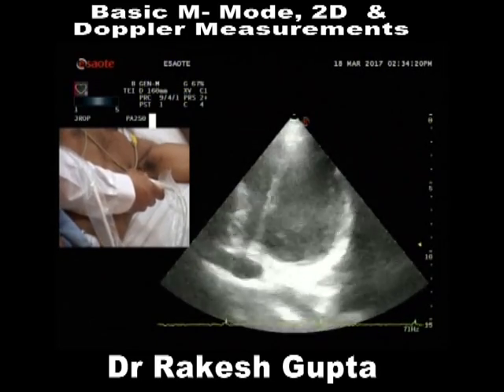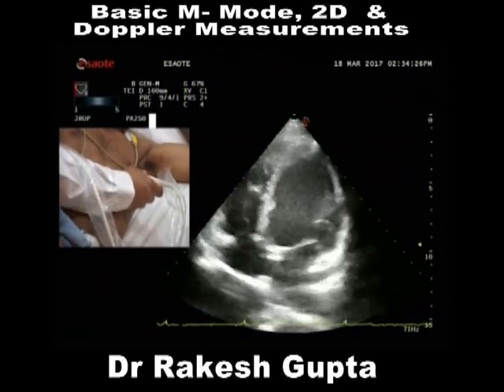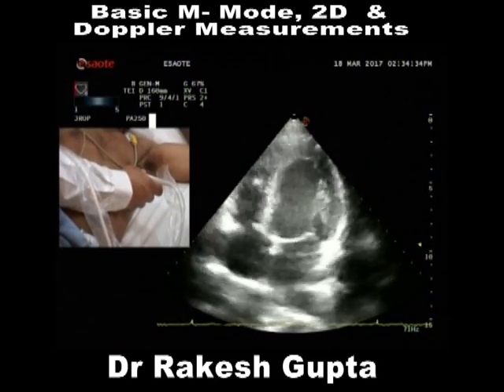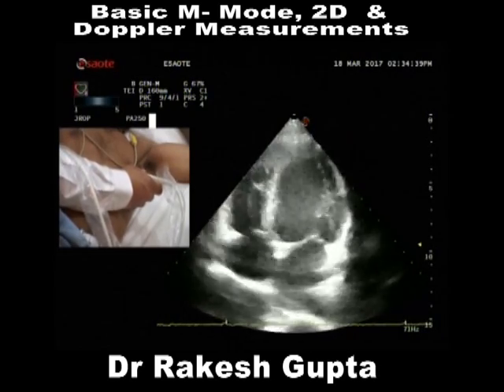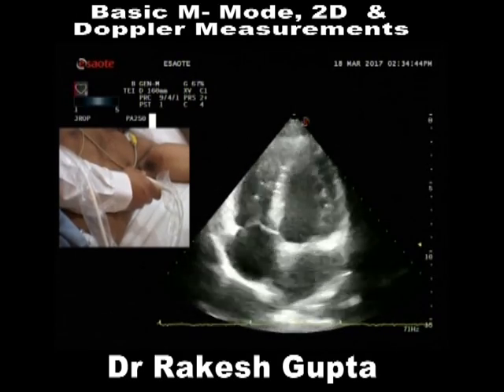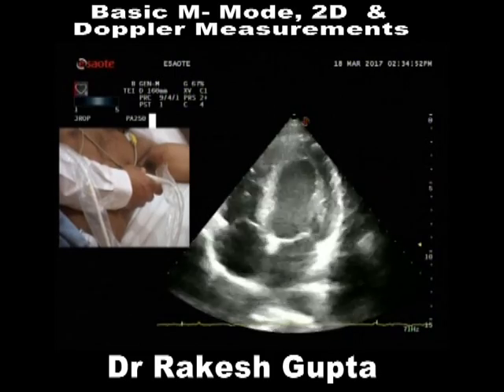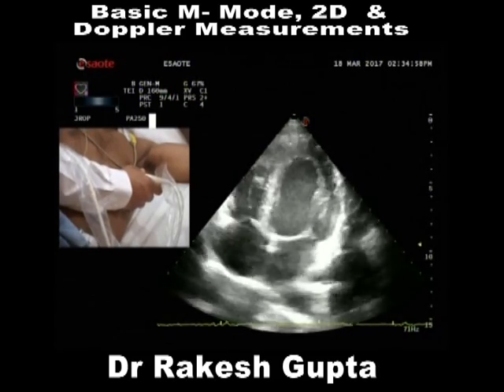But what we need is the image optimization. Look, this is a natural image. This is 2D optimization. And look, depth is almost 12 to 15 centimeters in every subject. We should be able to see a descending aorta here. This is the pulmonic vein, this is the descending aorta, rounded structures. So we should incorporate the descending aorta, we should be able to see a good endocardial delineation. Is that correct or wrong? Convinced?